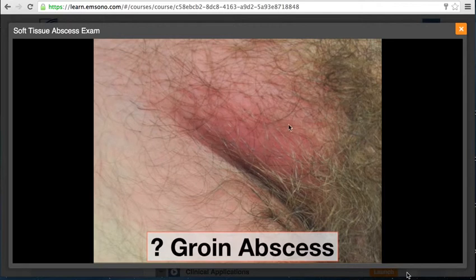Went ahead and took a look at the patient, and you could see just superior to the inguinal fold here that this patient has this markedly erythematous area. When I asked him how this started, he said that it started about 4 days ago as just a generalized erythematous area. The thing that didn't fit, this being a simple cutaneous abscess, is that there's no starting point. It wasn't a papule or an infected hair follicle. I don't see any areas to explain this being a cutaneous infection.